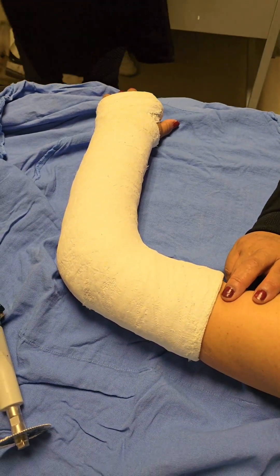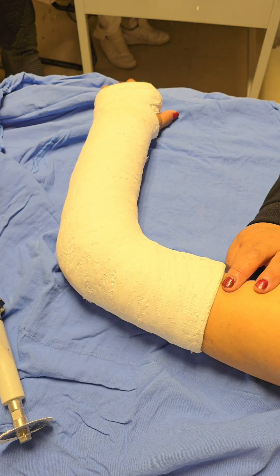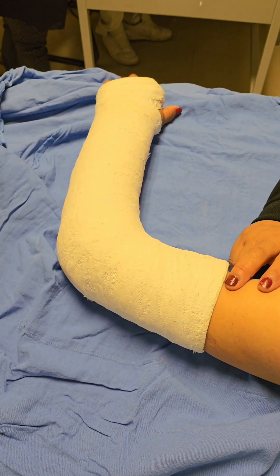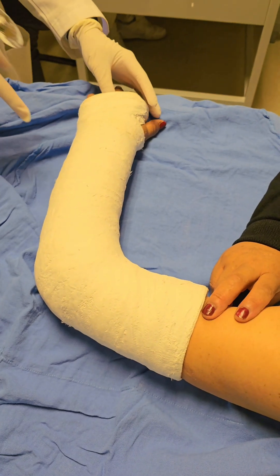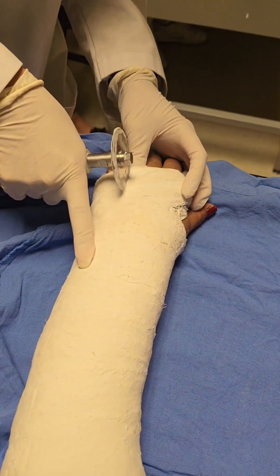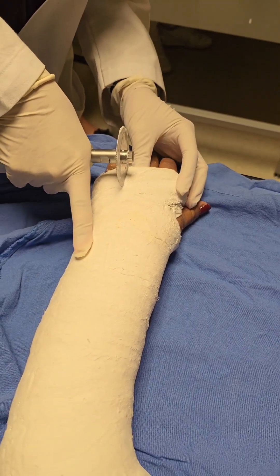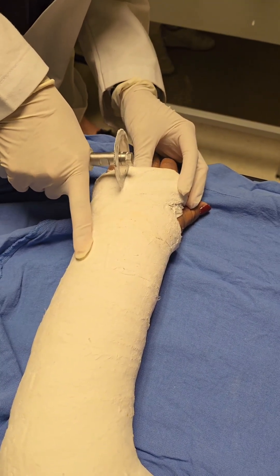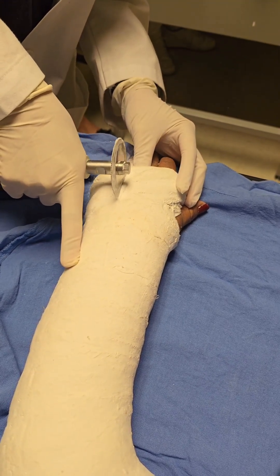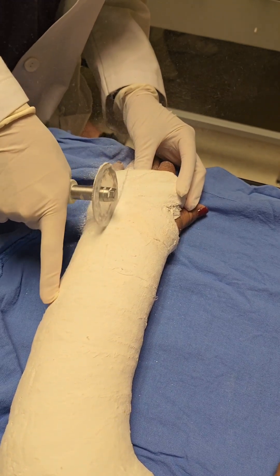Welcome back to the channel everyone. Today we're diving into a crucial and often misunderstood part of wrist fracture recovery: removing a wrist cast using a specialized cast saw. This might sound simple, but there's a lot more to it than meets the eye. If you've ever wondered how these casts are taken off safely, or if the thought of that buzzing saw makes you nervous, stick around. We're going to walk you through the entire process, debunk some myths, and show you exactly why this procedure is both safe and important.